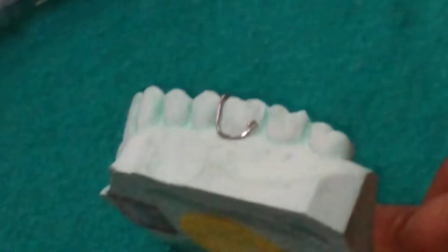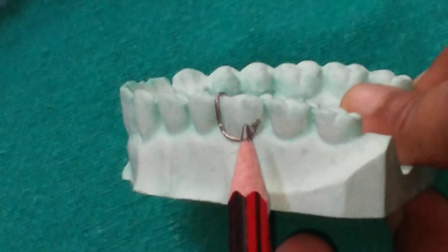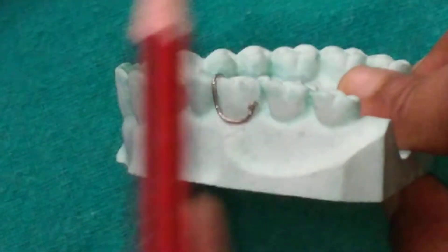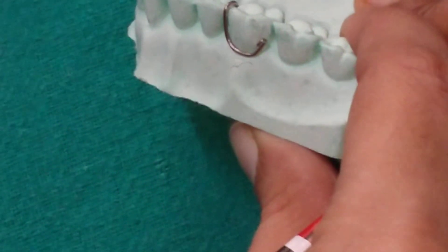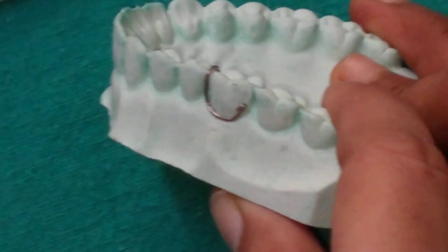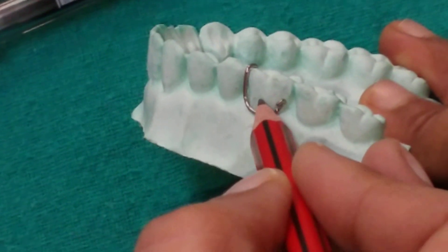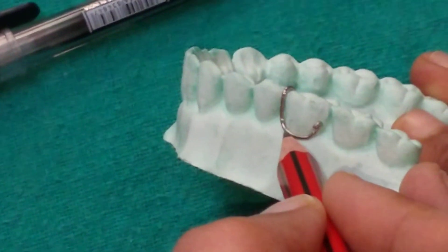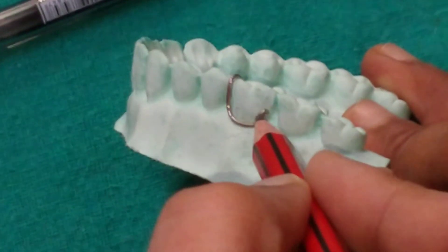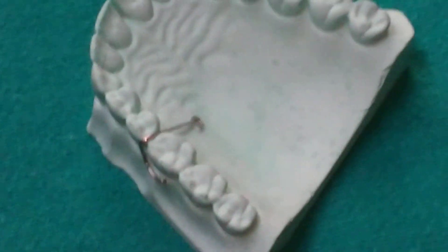A C-clasp, or circumferential or three-quarter clasp, engages the distal proximal undercut, walks the buccal cervical undercut, engages the mesial occlusal embrasure, and extends palatally. Its advantage is that it is easy to fabricate and can be used in fully erupted teeth. The disadvantage is that in partially erupted teeth the buccal cervical undercut is not accessible, so this clasp can only be given in fully erupted teeth.